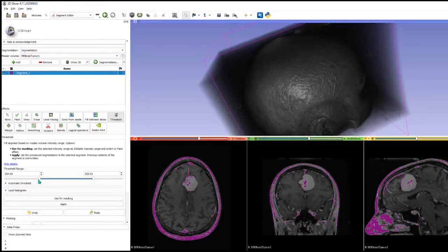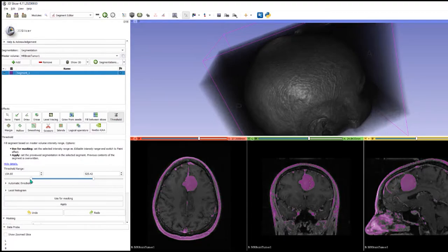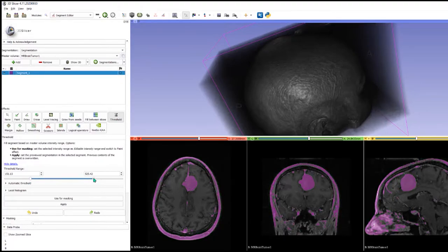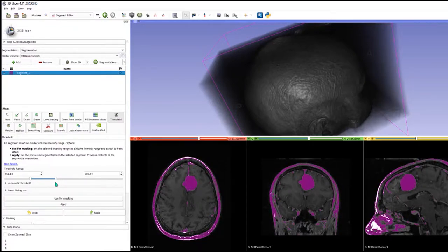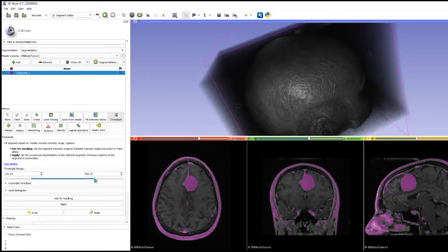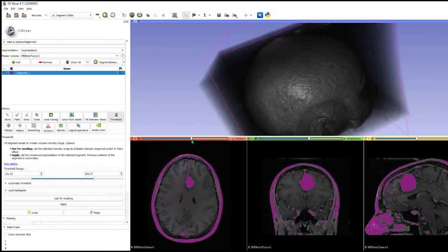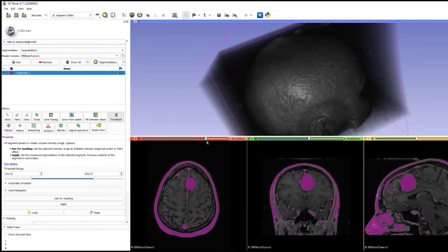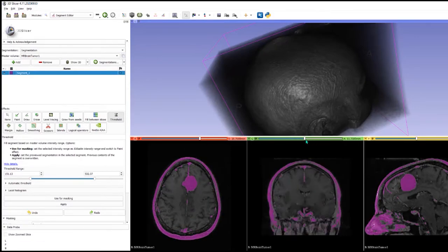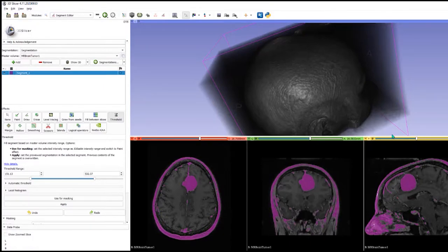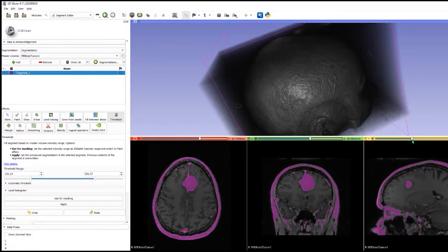There are other areas in the data which have the same color as the tumor, and that causes a bit of a problem. But let's go with that sort of range of intensity values because it gets all of the tumor. It gets all of the skull as well and other parts of the brain, but the tumor's there anyway as you can see quite clearly.